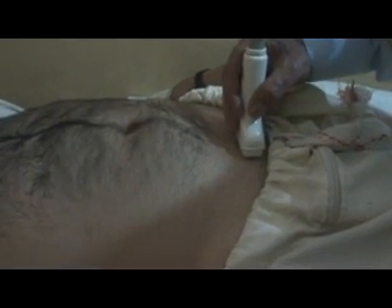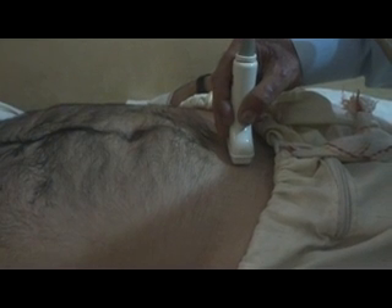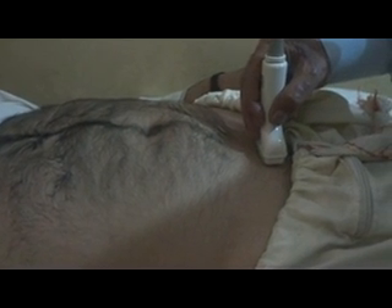Hi, this is a 26-year-young patient with a complaint of burning micturition.